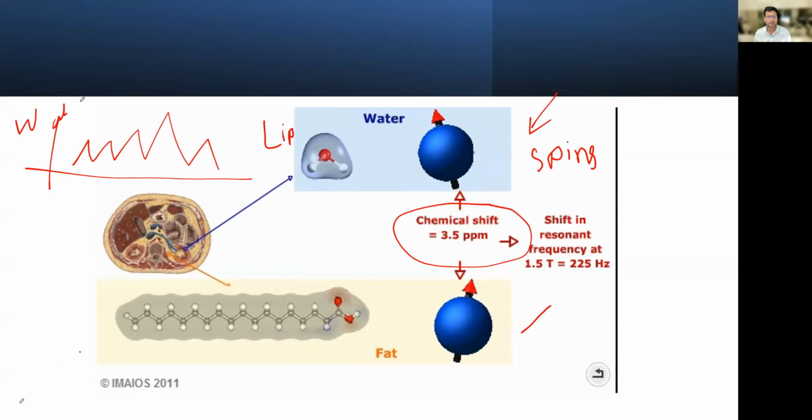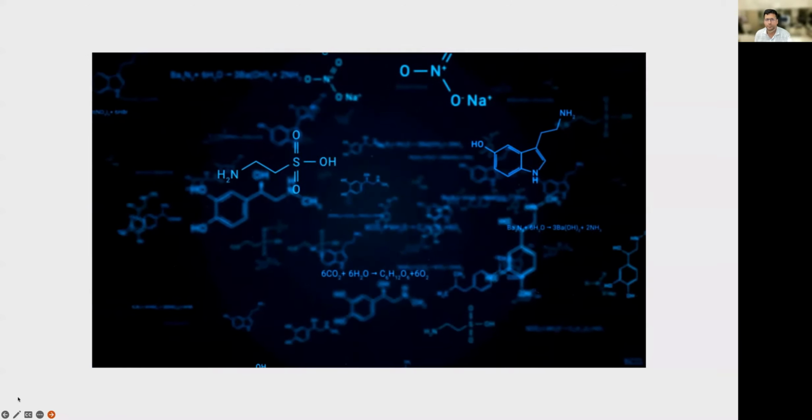What we are trying to tell you is that every metabolite you are seeing in MR spectroscopy falls between water and lipid. On the lipid side, you call it 0, and the other side is approximately 4. The difference is approximately 3.5 ppm. Between this, all the peaks fall. We use chemical shift imaging to diagnose conditions, to pick up the peaks individually, and we diagnose from individual peaks. This is the biochemical makeup, and we're going to go through it in the MR imaging.